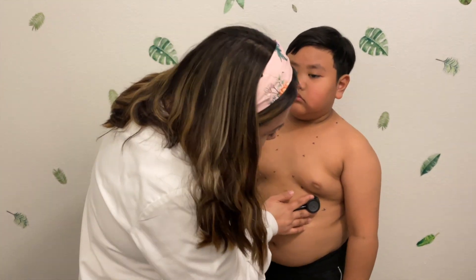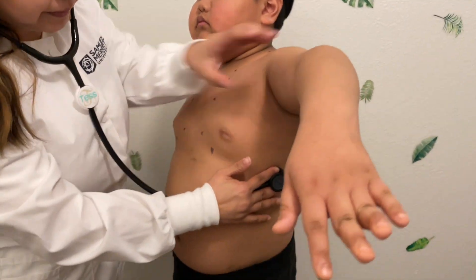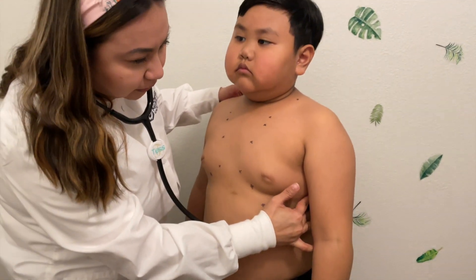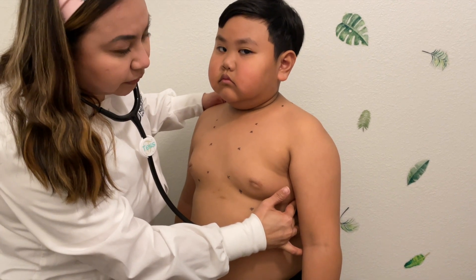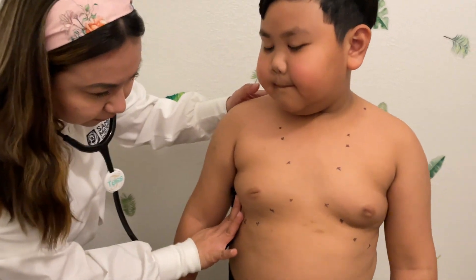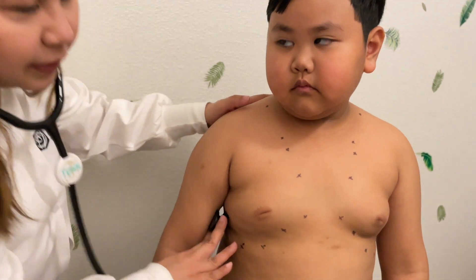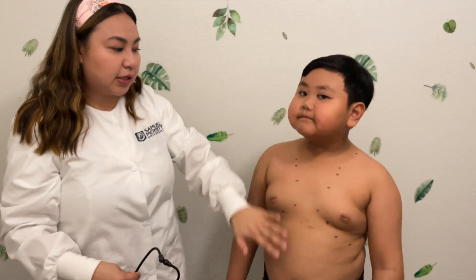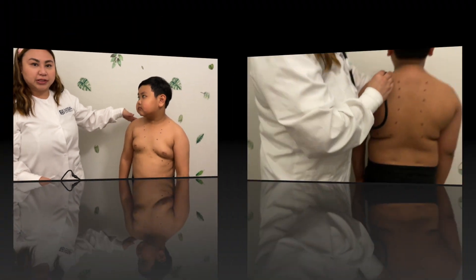If you could just position right here, I'm going to do the mid axillary. That was just the auscultation of the anterior side of the chest, and now we're going to do the posterior side.